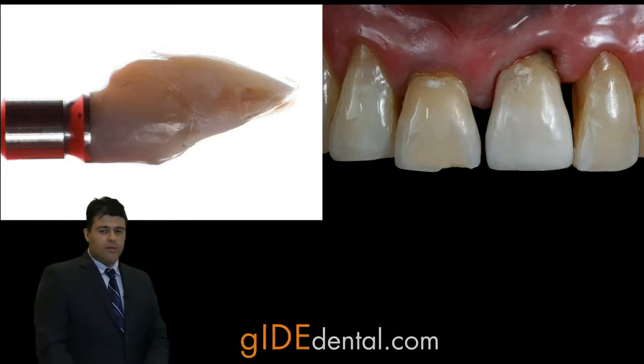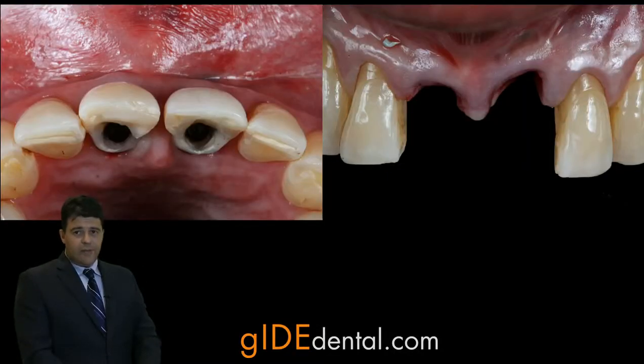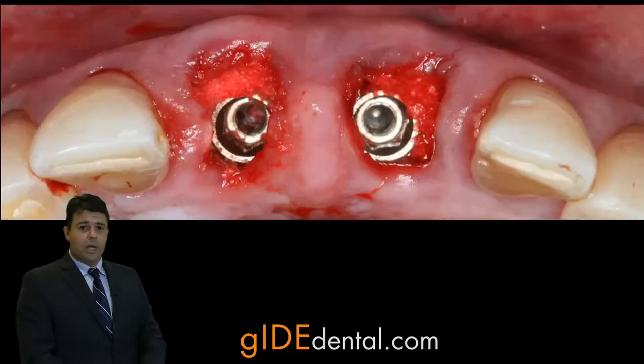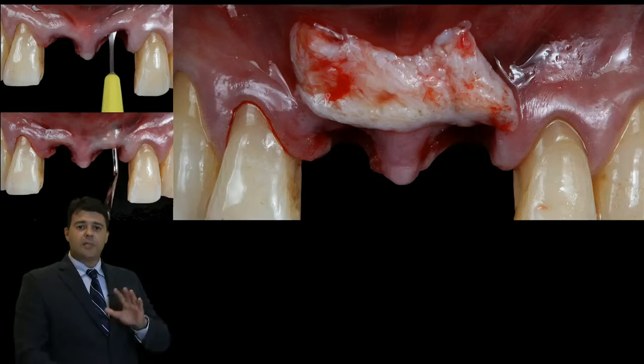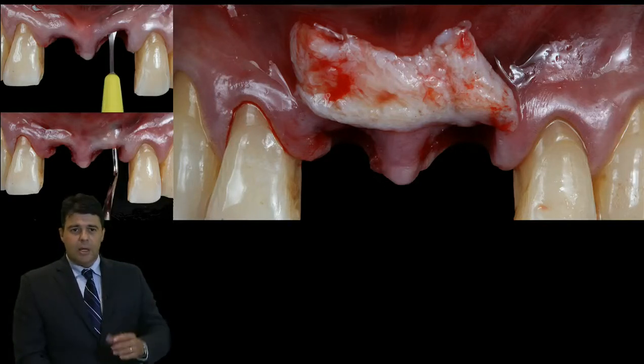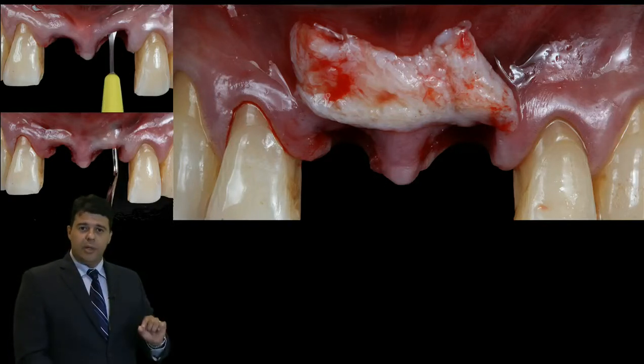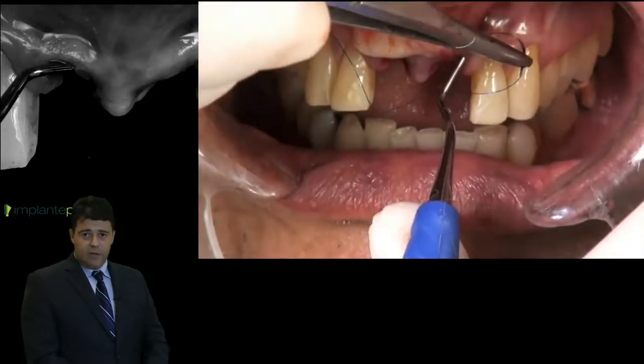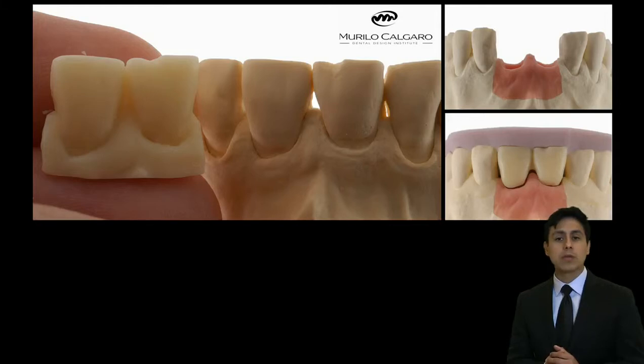So, it's very important. We can see the very nice shape of the papilla and the choice is the xenograft. It's very well packed inside to create a space in the buccal aspect but without touching the papilla. And this is the way we're going to do our fixation of the graft.